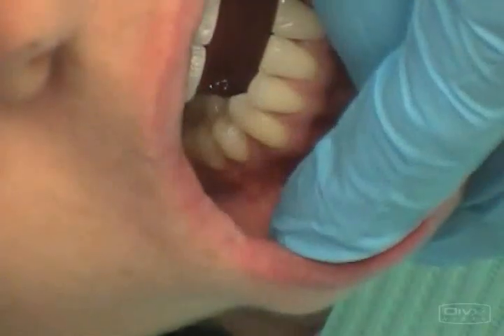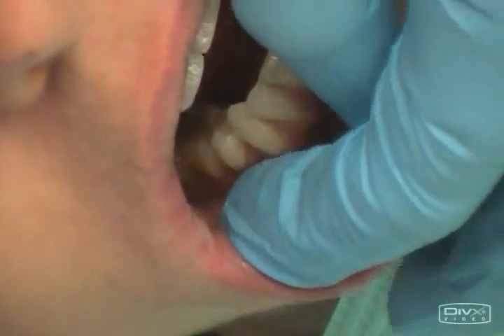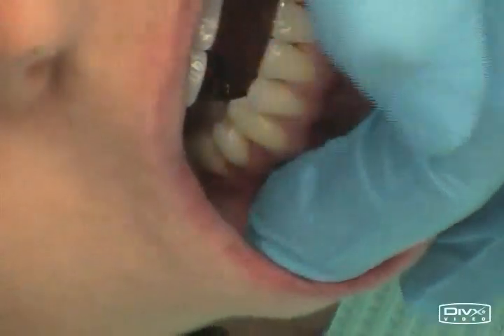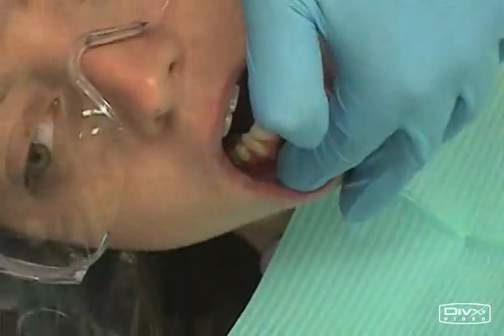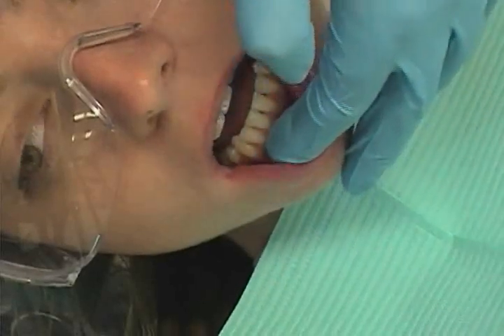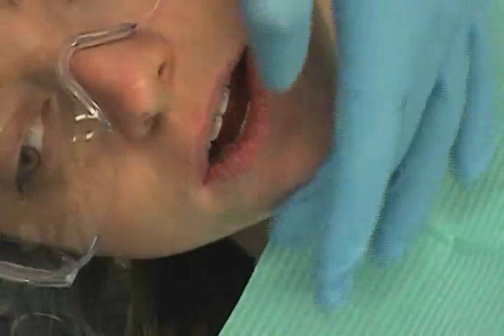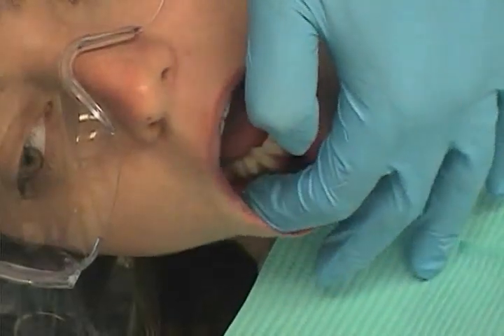This is the incisive or mental nerve block. The nerves are the mental and incisive nerves. The areas anesthetized are the buccal mucous membrane anterior to the mental foramen, usually from the second premolar to the midline, the lower lip and the skin of the chin, the pulpal nerve fibers to the premolars, canine, and incisors.